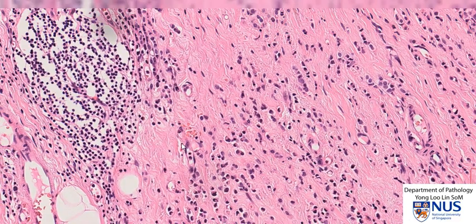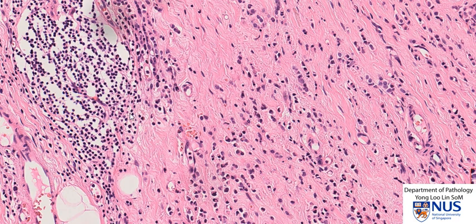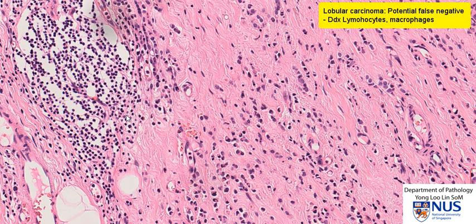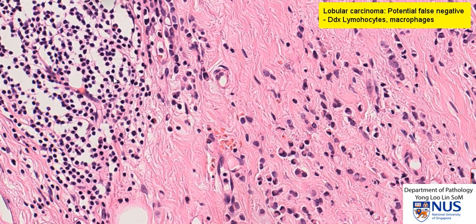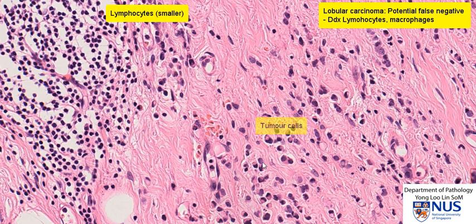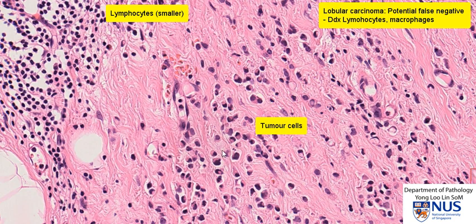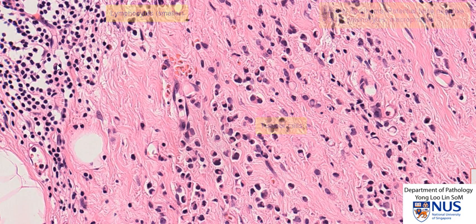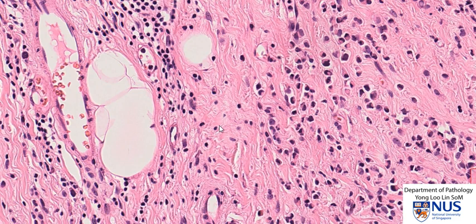Lobular carcinoma can sometimes be mistaken for other cell types like lymphocytes, and therefore they could just be missed and thought to be chronic inflammatory cells. Whereas if we look carefully here, here is an aggregate of lymphocytes, and these are tumor cells. If you compare them, you can see that the tumor cells are actually larger than lymphocytes. But we have to be aware of this potential pitfall in order that we do not miss lobular carcinoma cells.